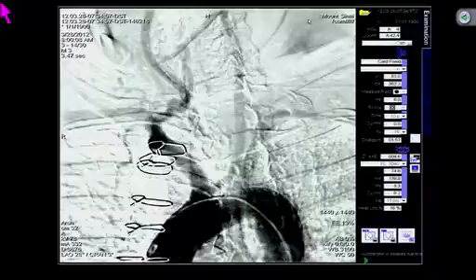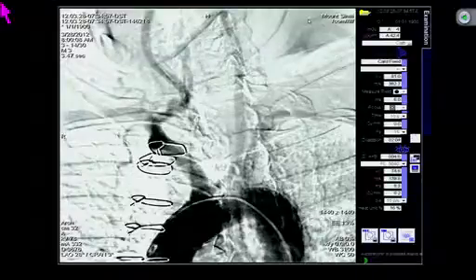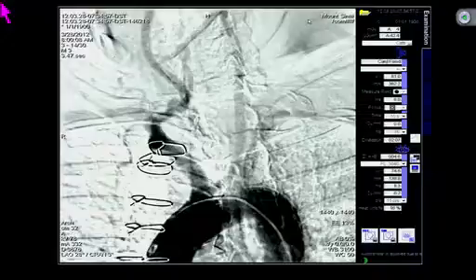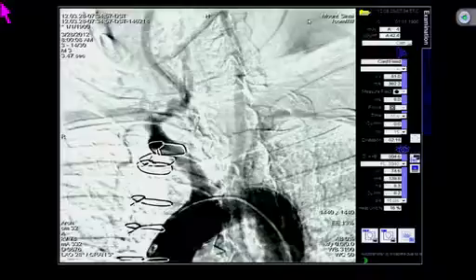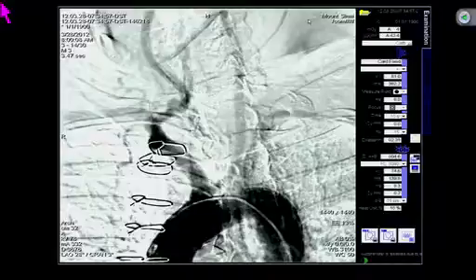I know you've got one at the time of CAT scan angiography if you happen to do it, but it gives me and Dr. Wiley a lot of information in terms of the origin of the subclavian, the type of catheter that we're going to choose, and also whether there's any ulceration or aneurysms at the site where the intervention is going to occur. Obviously, if you had a thoracic aneurysm associated with subclavian stenosis, it's going to totally change your management, and probably you're not going to take an endovascular approach. If you have thrombus sitting at the area of intervention, it's also going to change. Or if you have an anomalous subclavian artery origin, it's also going to change your approach. So it's extremely important to get that pre-imaging before you do your intervention.